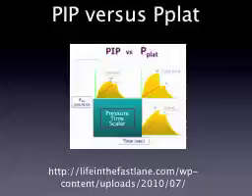So the peak inspiratory pressure, the PIP, if you look at that one that says normal there on the left, is the highest pressure encountered in the airway upon delivery of a breath. So we're talking about inspiration. So it's the highest pressure, and you can see it there as a little peak. And then what I do is I do something called an inspiratory hold, where I just hold it for a little bit at the end of inspiration. And what that does is that actually measures the pressure in the alveoli themselves. This is always going to be lower than the PIP. And generally the PIP and the P-plat will go together. They should correlate well.